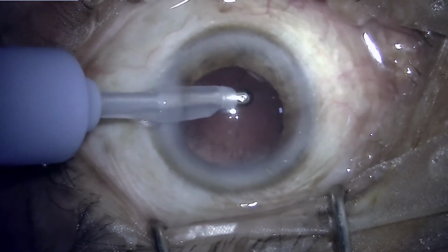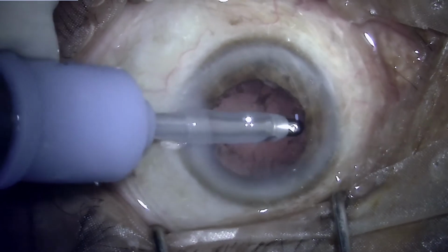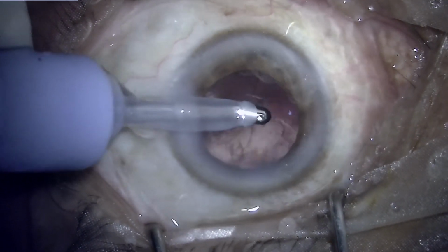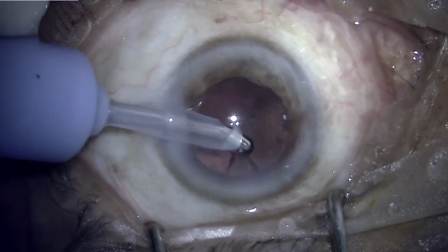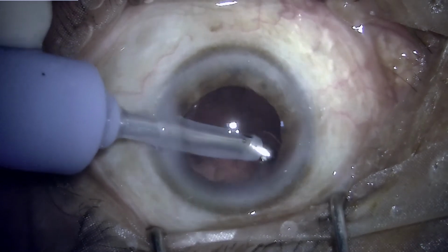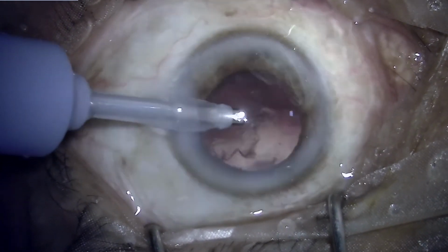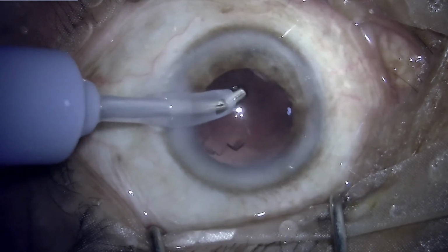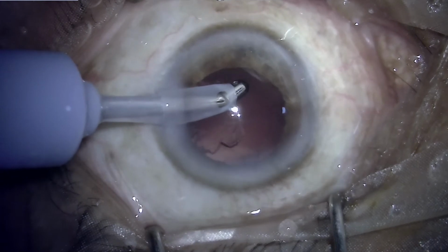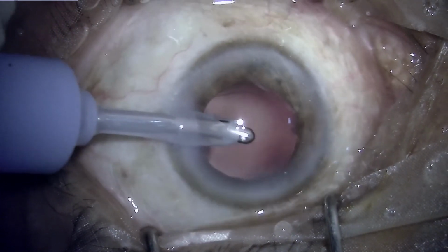So here we can see the nucleus has been consumed now, and just some amount of cortex is left behind, and this now becomes a routine situation where the cortex will be peeled away from the posterior capsule by catching hold of the anterior end of the lens fiber. It's always important to keep a watch on the aspiration port so that it is facing towards the surgeon, so as to be confident what is being aspirated inside.